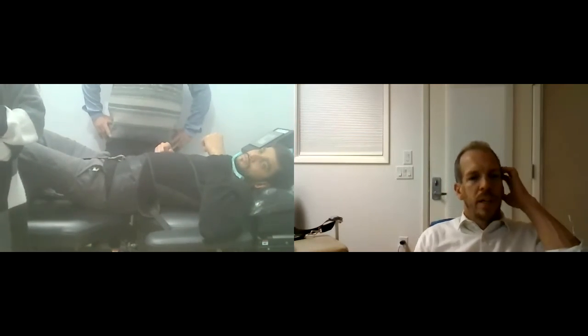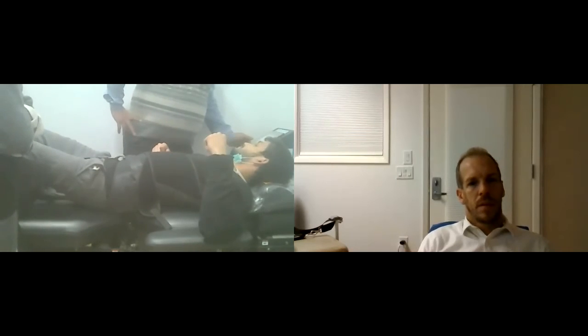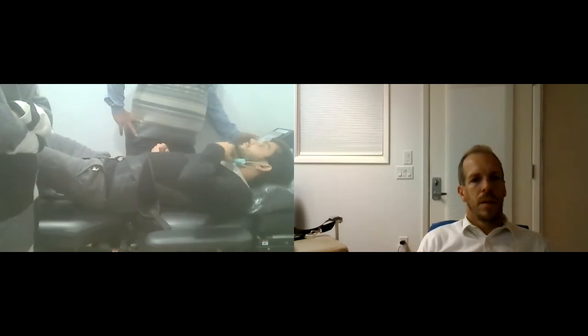Now, do you see on your computer where it says current force? What is your current force? It's 4, 5.